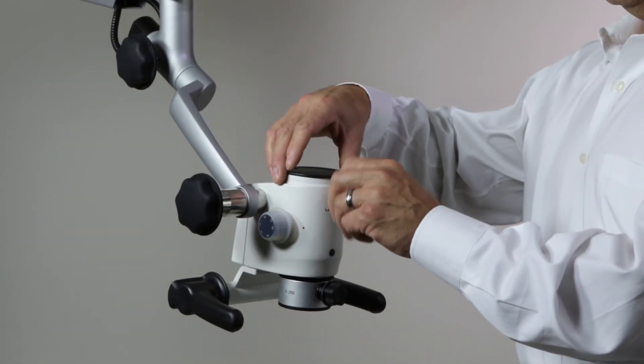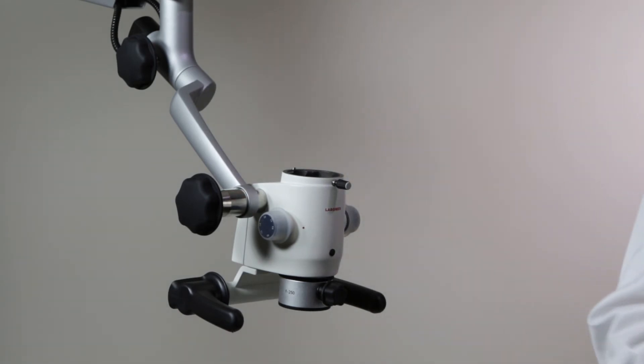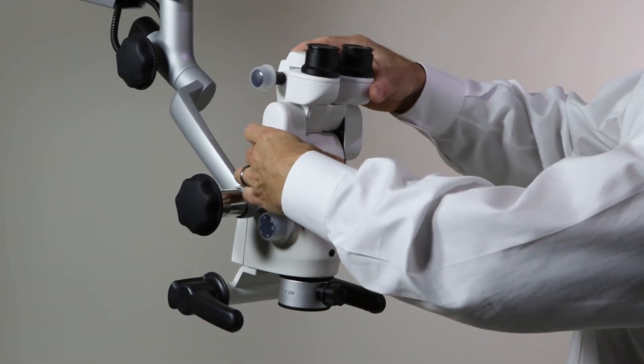Remove the dust cap by loosening the thumb screw in front of the microscope body. Place the binocular head and retighten the thumb screw.